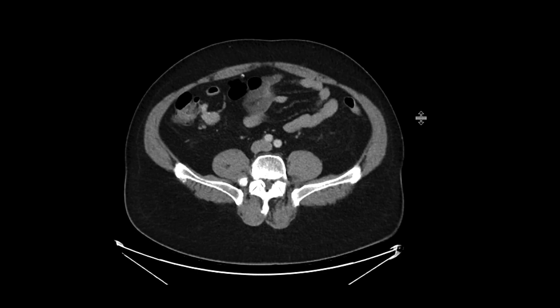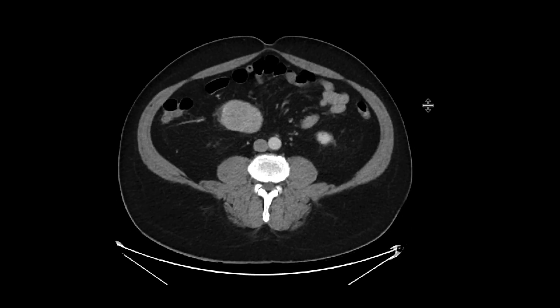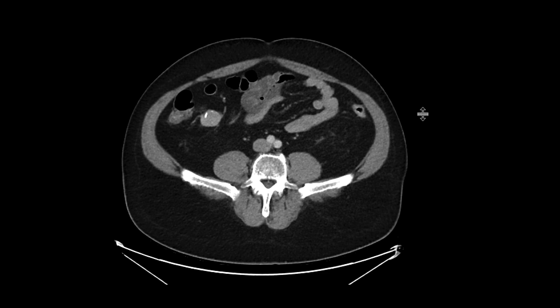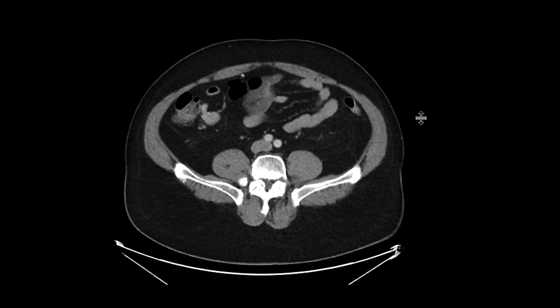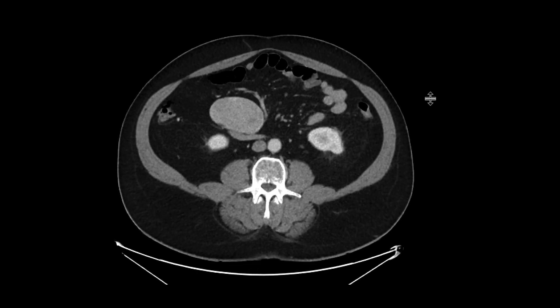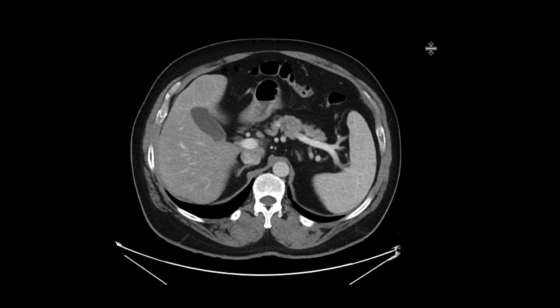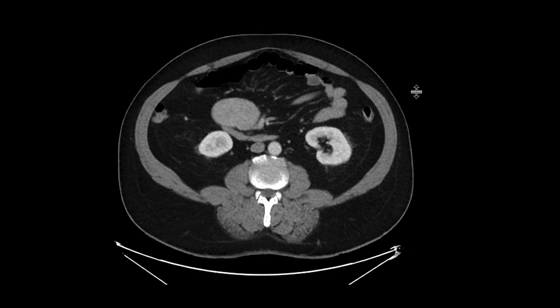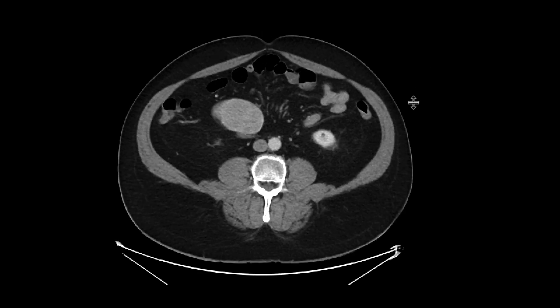Just looking at those nodal masses, one would need to be worried about carcinoid tumor nodal metastasis, especially given the calcification associated with the smaller one. Certainly carcinoid can go to the liver, so this may well represent a carcinoid metastasis.